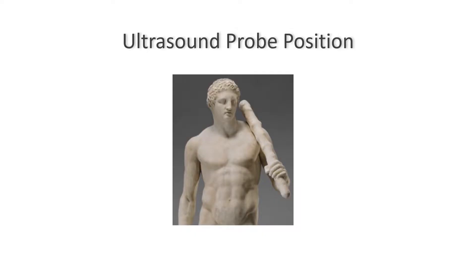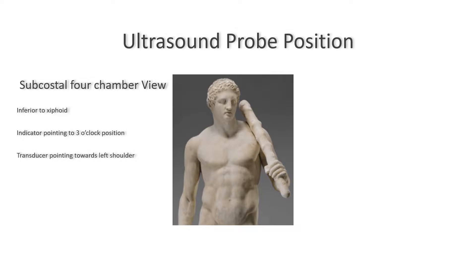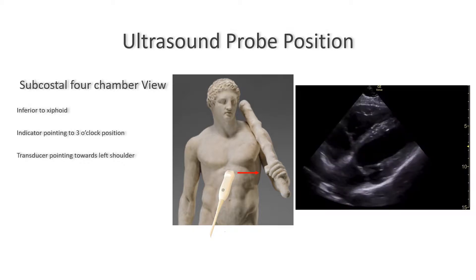Let's first talk about the ultrasound probe position. With the patient in the supine position, place the transducer flat at about two centimeters inferior to the xiphoid process. Have the indicator of the probe pointing towards the left of the patient at about a three o'clock position. The transducer itself is pointing towards the left shoulder.